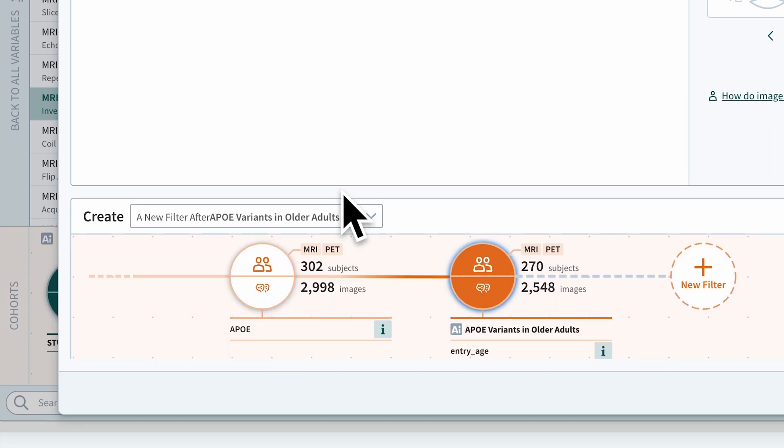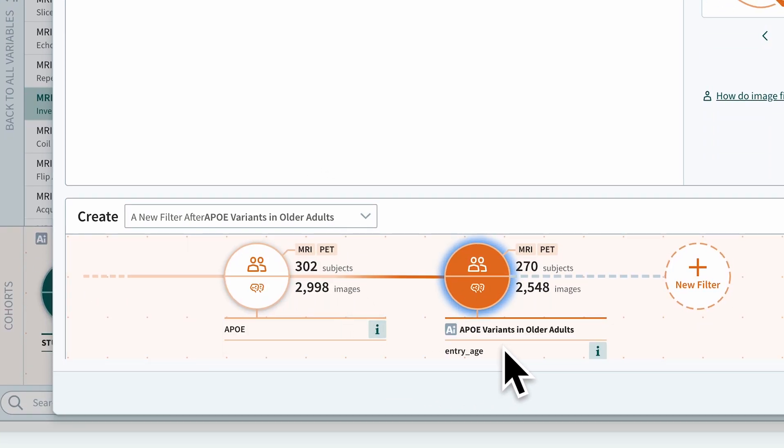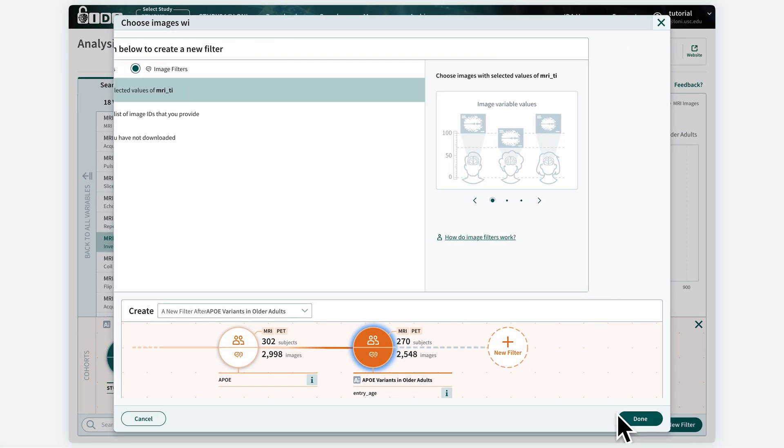And we want to add the filter after the existing cohort of APOE for subjects who are 65 years old or older. Then click the Create New Filter button at the bottom.